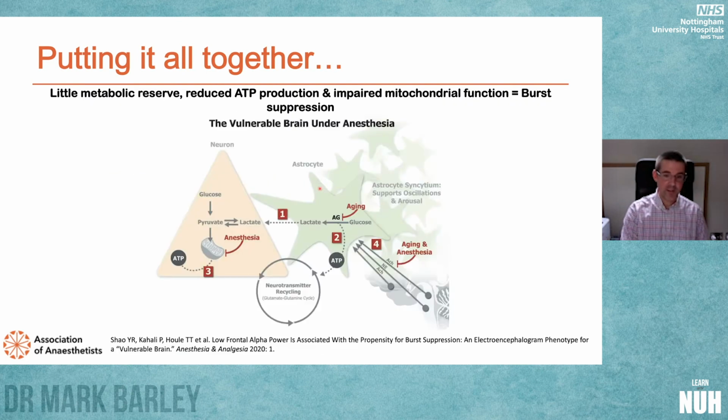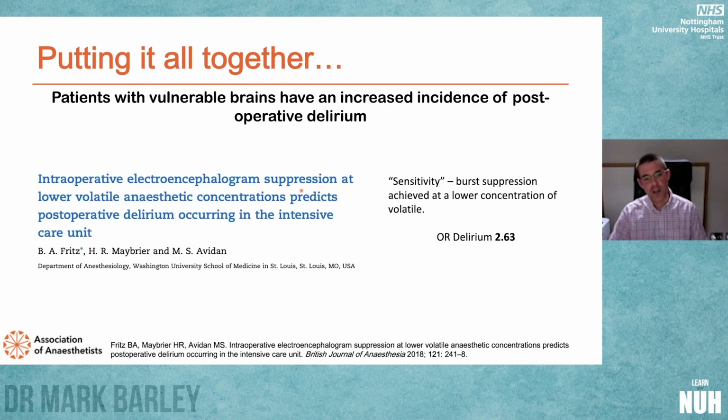We can't identify these patients unless we use a BIS monitor. I think there's far more to processed EEG than just being something to do with awareness, which was the marketing gambit in the late 90s and early 2000s. The brain is trying to tell us much, much more.